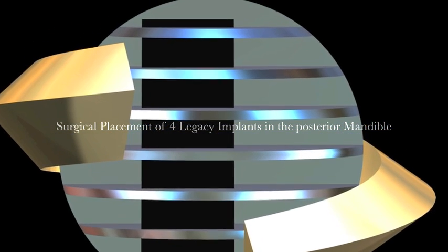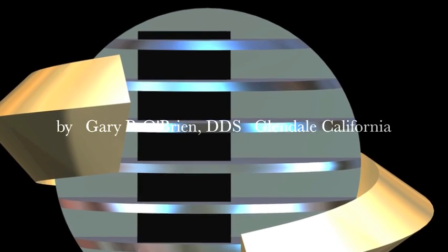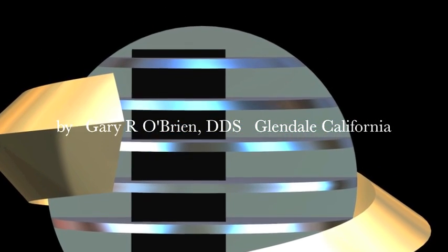This is Dr. Gary O'Brien. In this video, we will be placing four Legacy III implants in the posterior mandible.